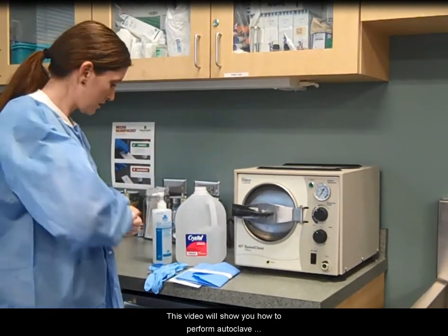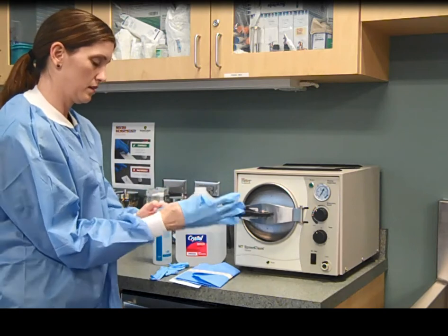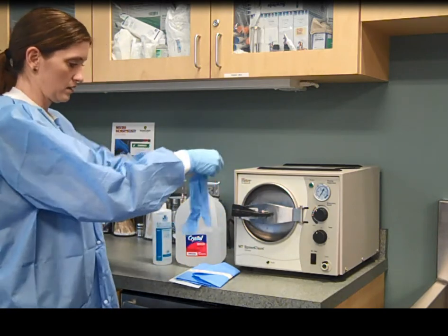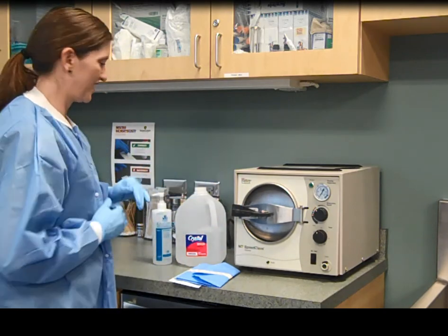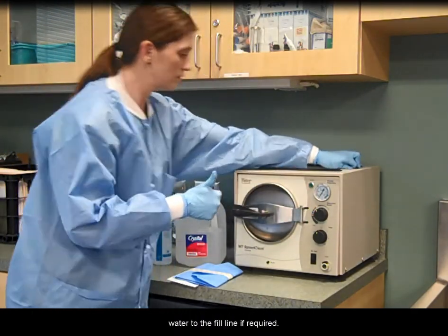This video will show you how to perform autoclave sterilization. Wash hands and apply gloves. Check the water level in the reservoir and add distilled water to the fill line if required.